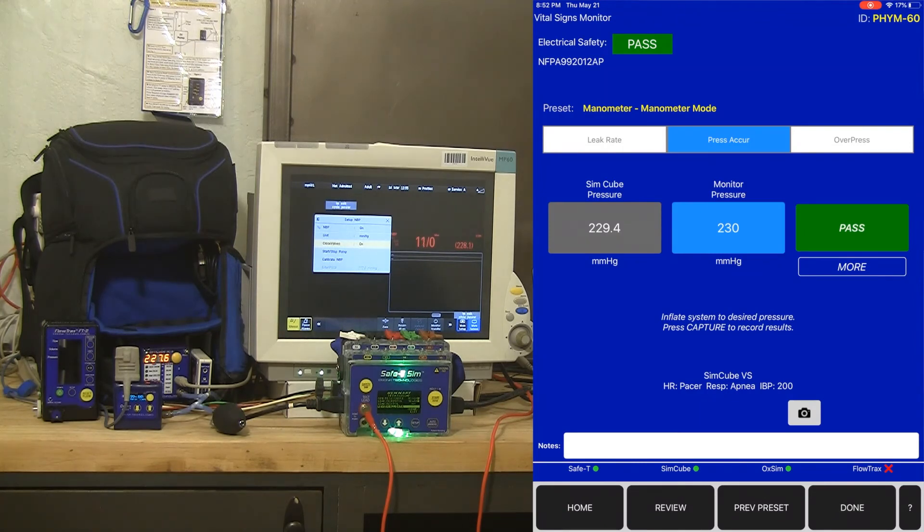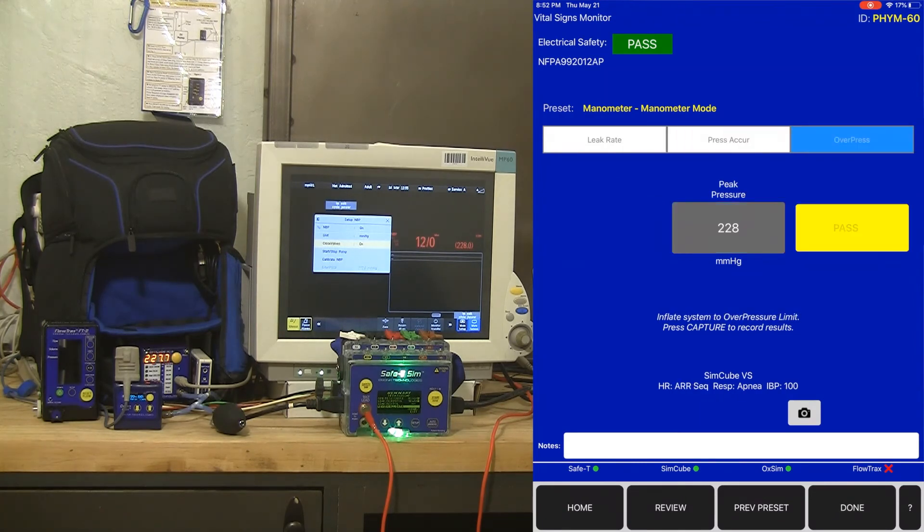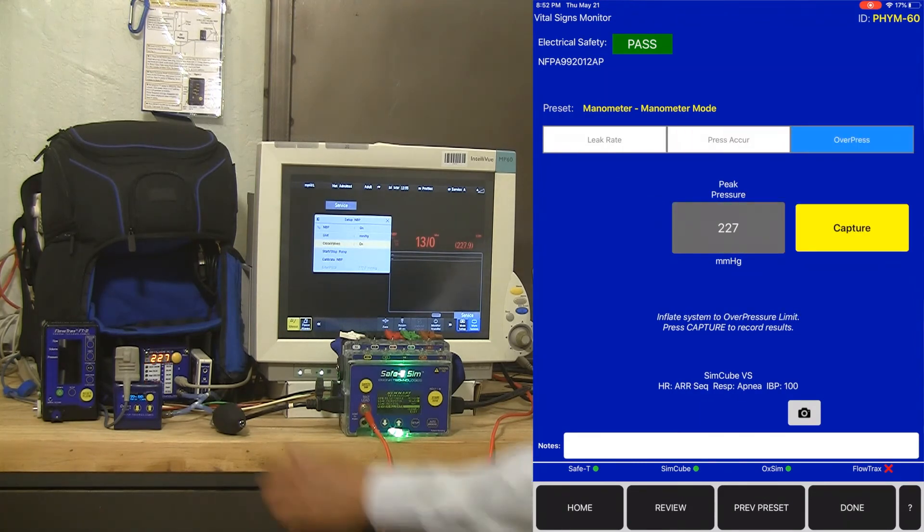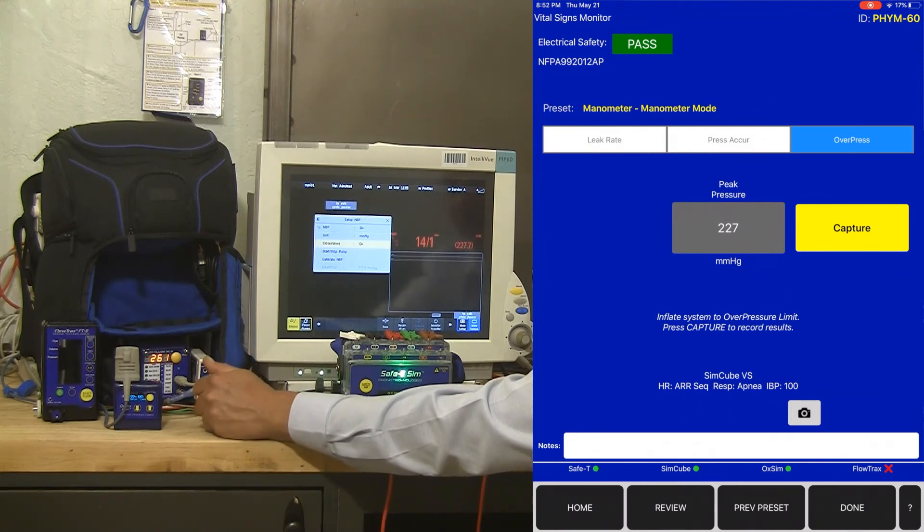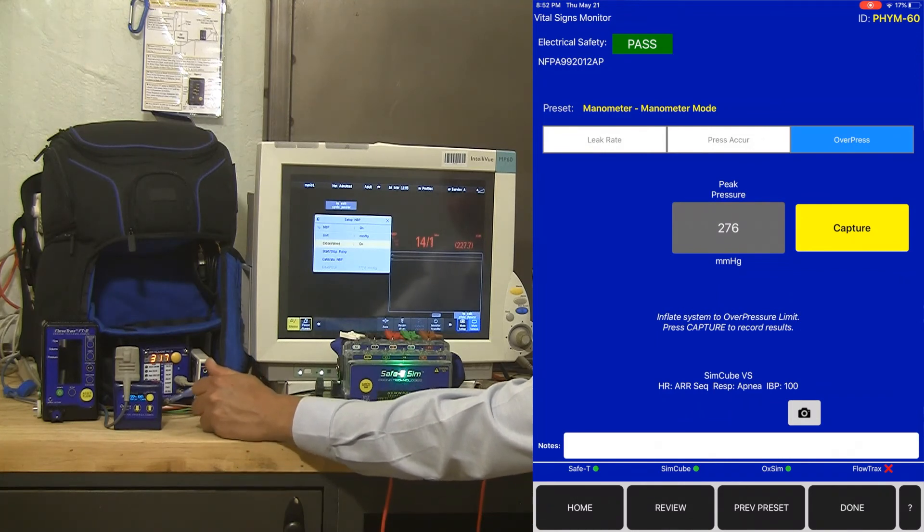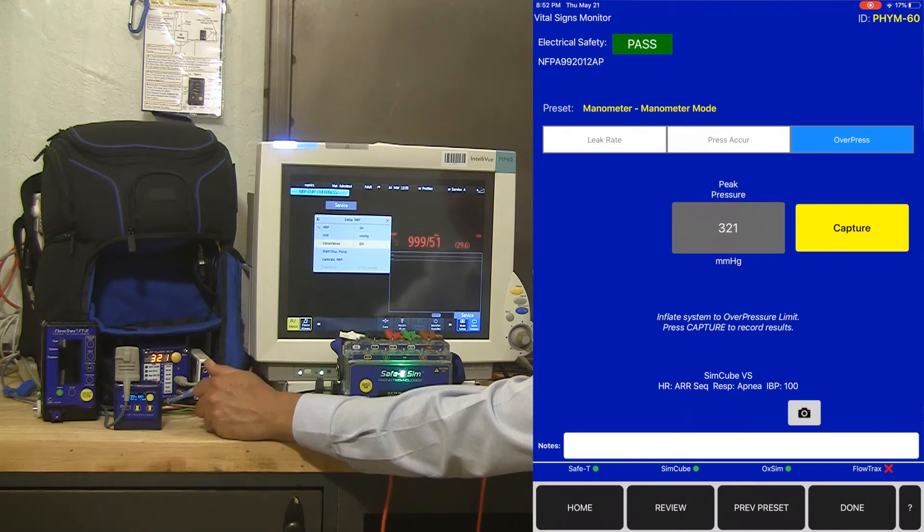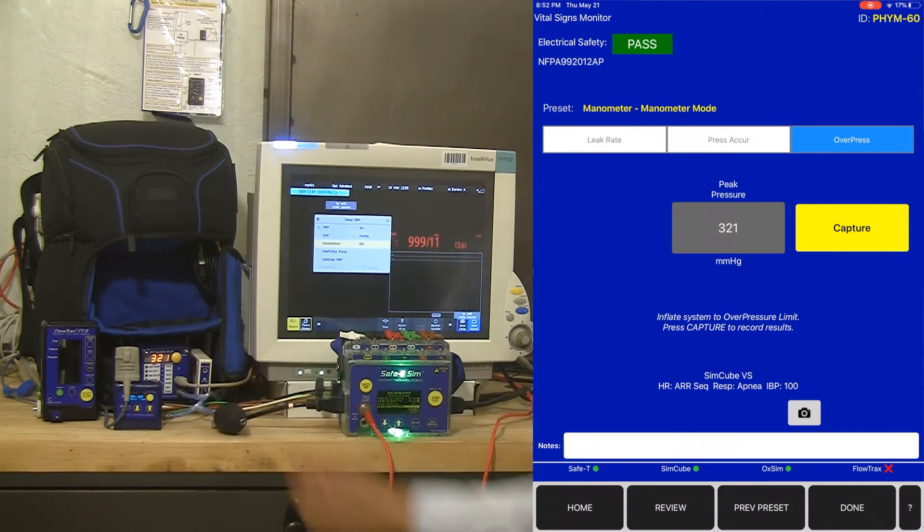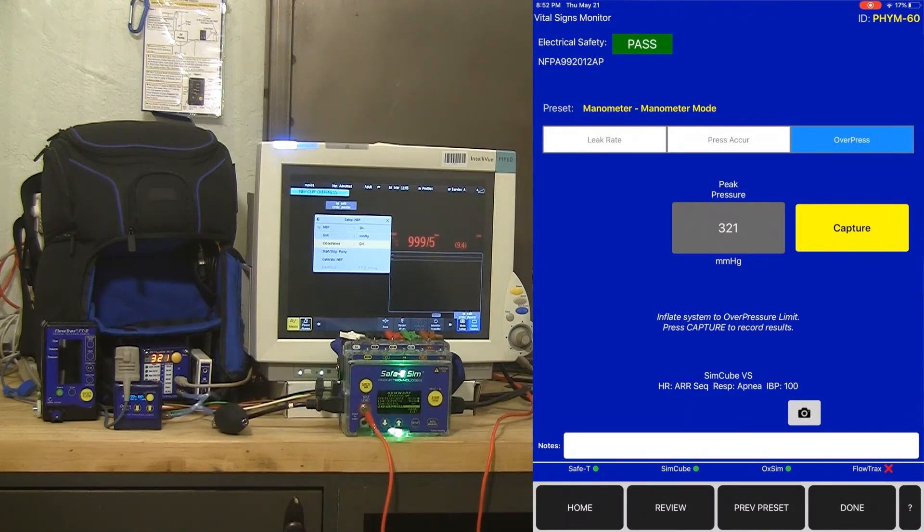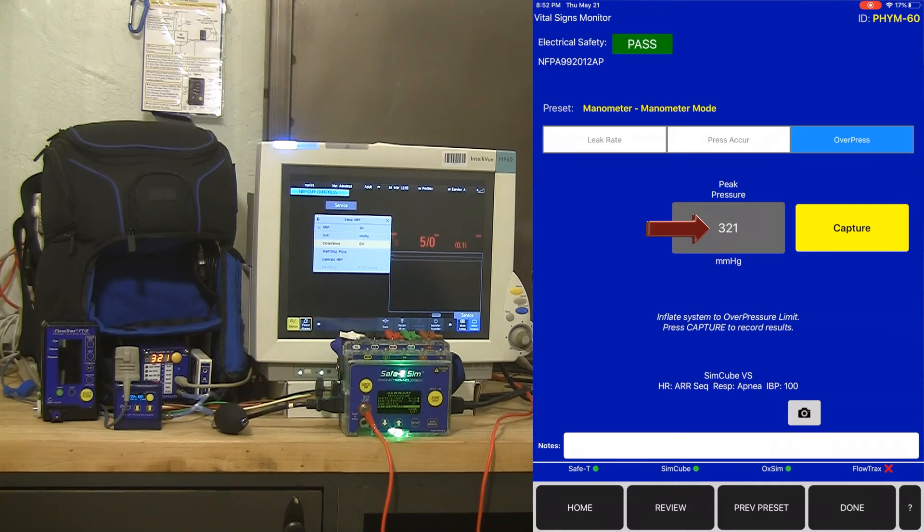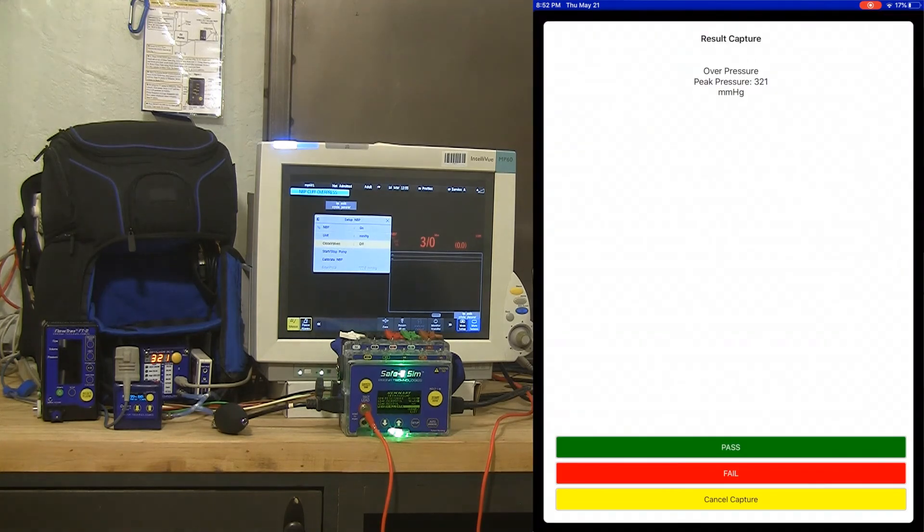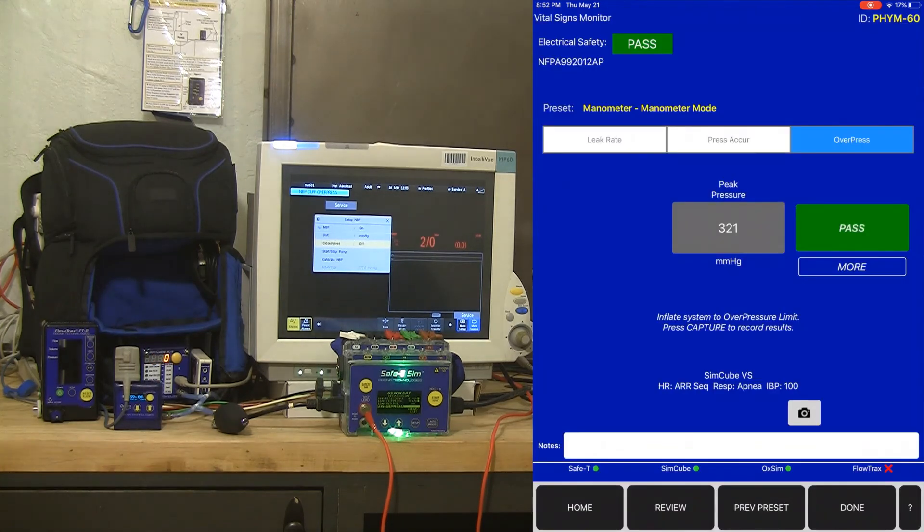Now I'm ready to do an over pressure test. So I'm going to inflate the system higher and look at my peak pressure when the vital signs monitor dumps the pressure for the over pressure limit. We can see the peak pressure was captured by the iOS device because of that real-time data coming from the SimCube via the Bluetooth communications. I hit capture. I've now got my peak pressure at 321 captured. That's a pass and I am done.